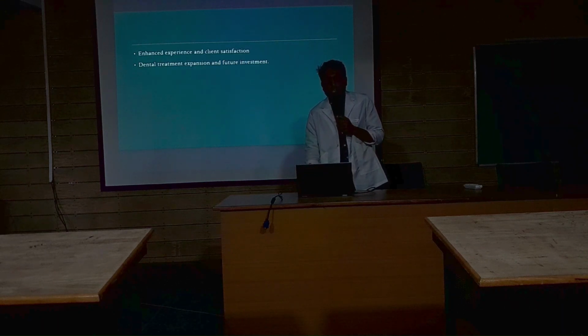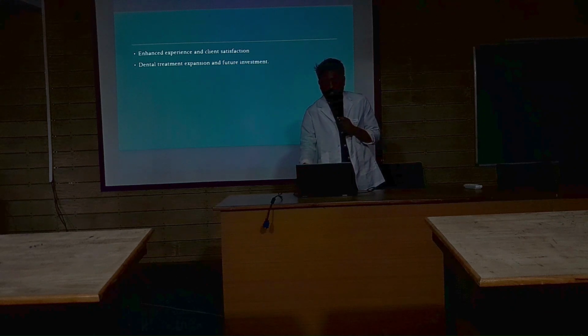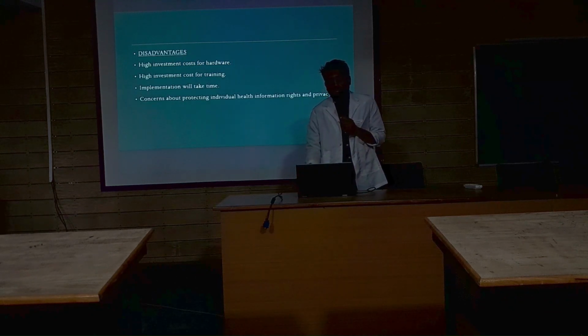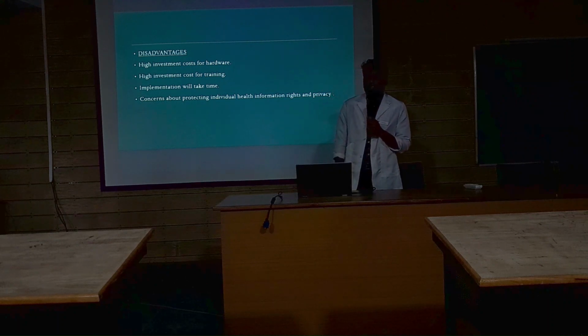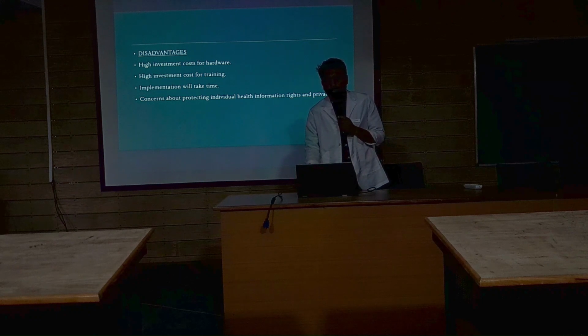Then enhanced experience and client satisfaction. Then dental treatment expansion and future investment. So what are the disadvantages? We have high investment cost for hardware, high investment cost for training, implementation will take time, and there are concerns about protecting individual health information, rights and privacy.